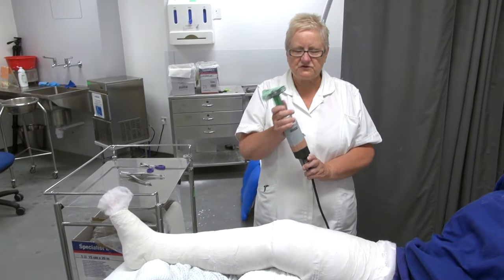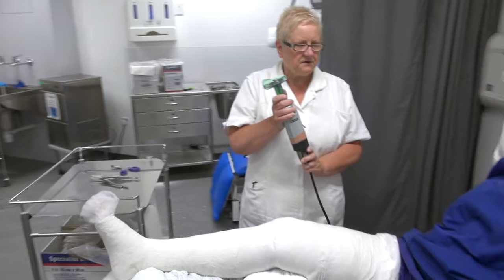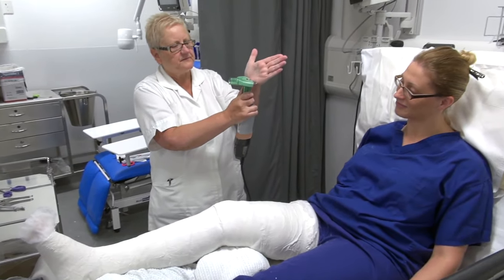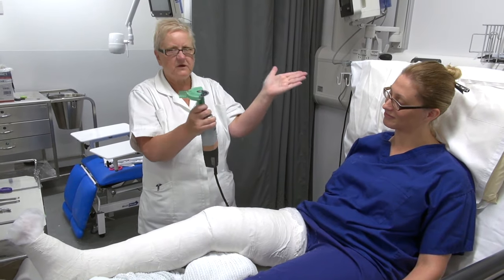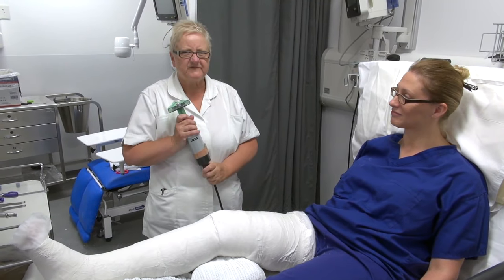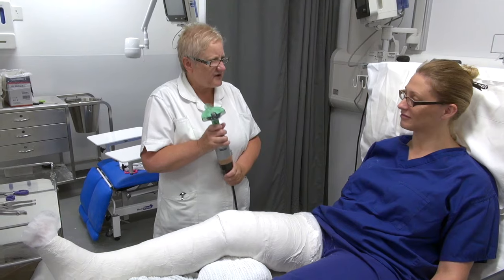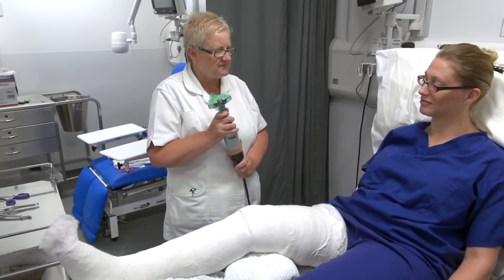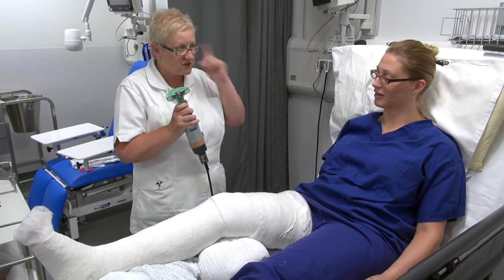Just to say — this saw will not cut you. What you may feel is vibration; it will not cut you, you'll feel the vibration. If you want me to stop, just raise your hand because I can't hear you.